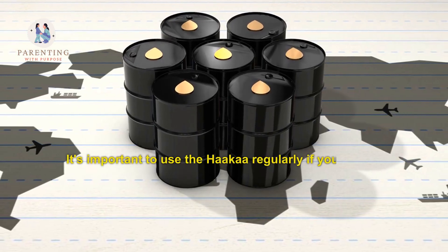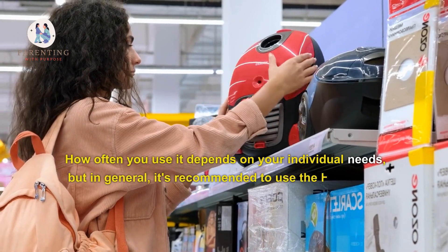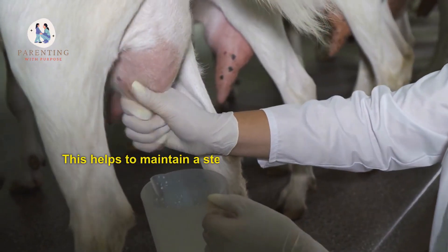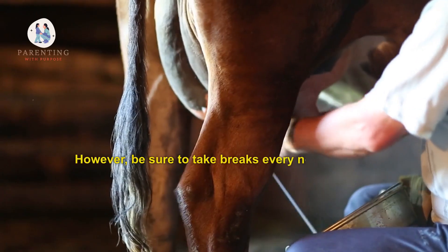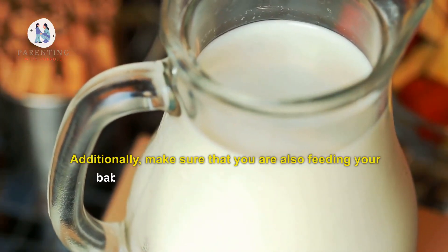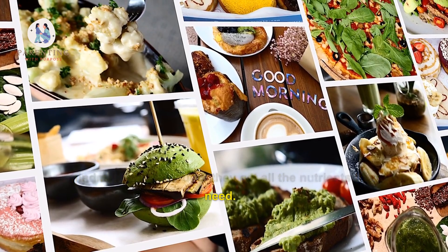It's important to use the Hakaa regularly if you want to ensure that your breast milk supply remains consistent. How often you use it depends on your individual needs, but in general, it's recommended to use the Hakaa for about 5 minutes each time before or after breastfeeding, or both. This helps to maintain a steady milk flow and keeps your breasts comfortable and healthy. However, be sure to take breaks every now and then, as overusing the Hakaa can lead to sore nipples or engorgement. Additionally, make sure that you are also feeding your baby directly from the breast when possible, as this allows them to draw out more foremilk as well as hindmilk, which ensures they get all the nutrients they need.